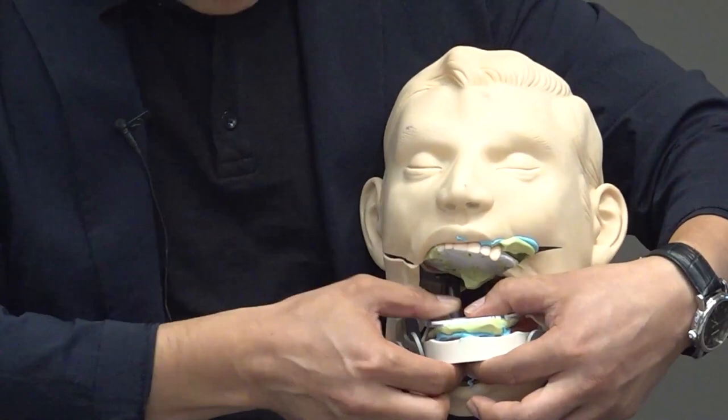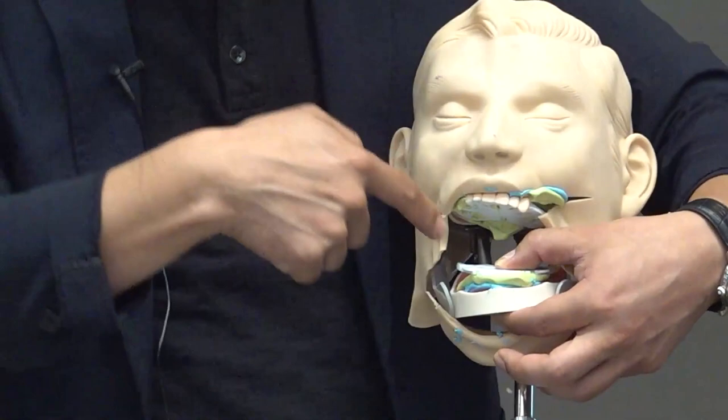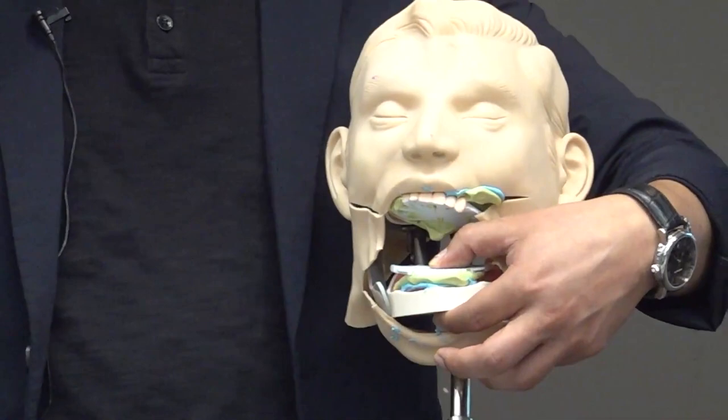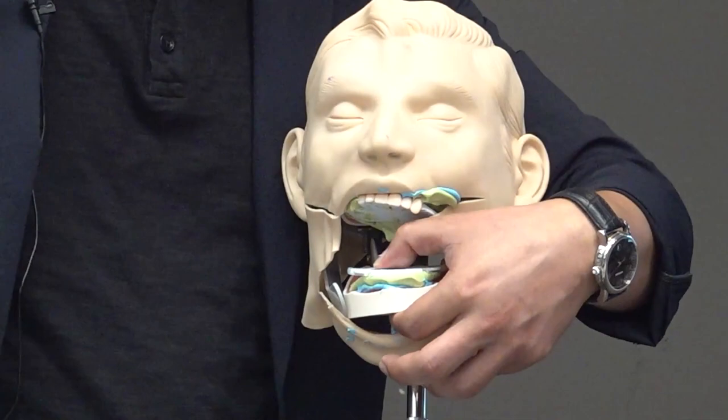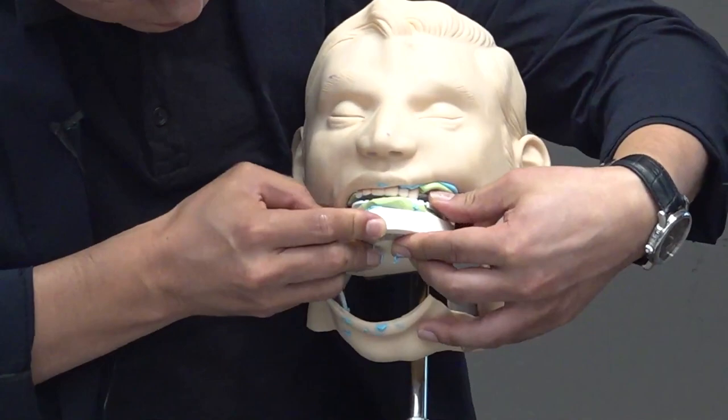And then this whole groove is for packing the silicone material on the ridge side, so it does not move. You can see the wing shapes, okay? The central arch is for retraction of the tongue posteriorly. And the lateral arch is for putting your fingers on this side. Then put the silicone material on the ridge side. Oh, sorry, a bite. Okay? And then you can measure the vertical dimension and take the CR.